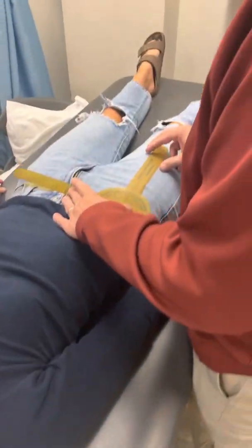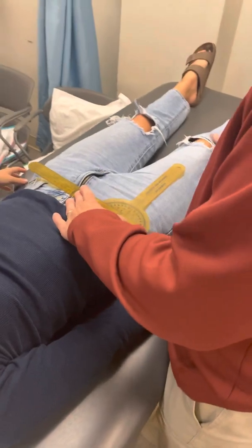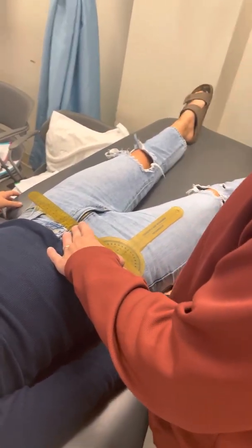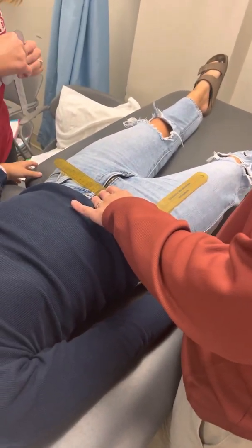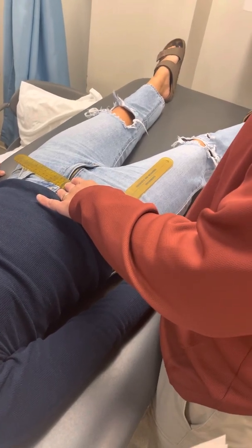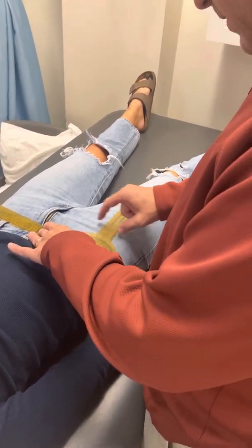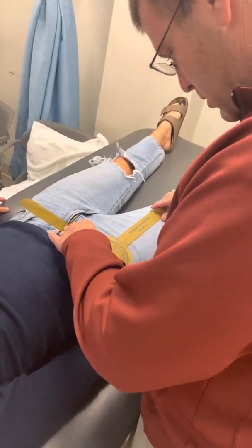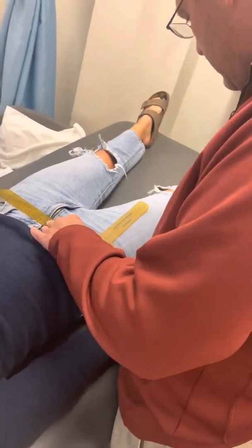All right, now with this, guys, you've got to watch. You want this at 90 degrees. That's your starting point. Because if you look, what's our range of motion for abduction? 45. What about adduction? 30. See, we're starting with this at 90, so remember, this is your starting point. You've got to translate when you move.